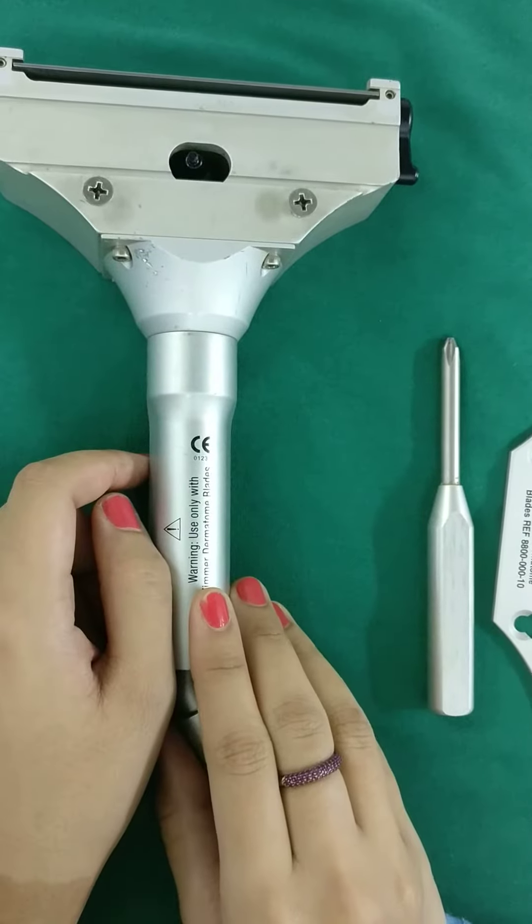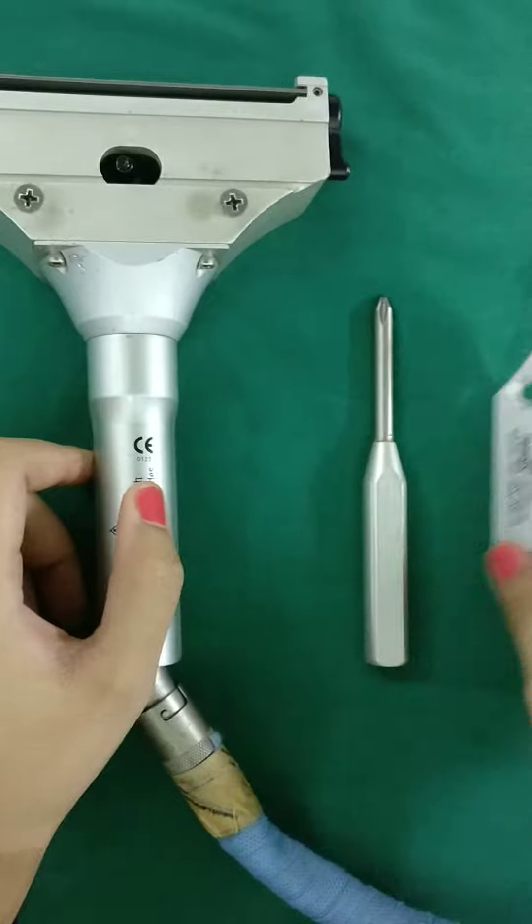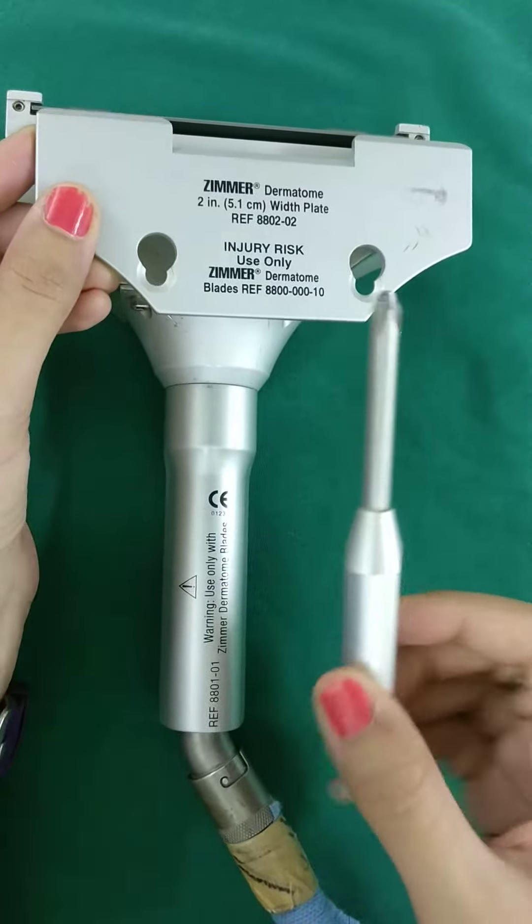Then we shifted over to pneumatic dermatomes. This is connected with a pneumatic outlet and used to require a lot of assembly — the blade goes here, you need to put this back on top, and you have a screwdriver for fixing it.